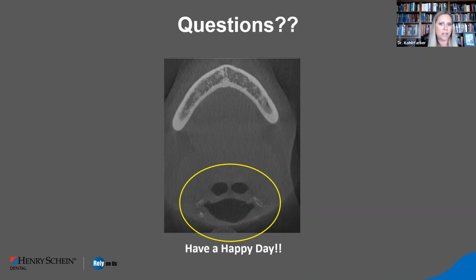In fact, all of my PhD was looking at segmentation and accuracy of segmentation. And we definitely found that the semi-automatic or even manual segmentation is going to be much more accurate than an automatic segmentation tool. There are various thresholds. So some of your software, you might think it's automatic, but it's actually semi-automatic, and you can play with the thresholds a little bit to make it more accurate. But yeah, automatic segmentation is not going to be nearly as accurate as a semi-automatic threshold-based or a manual segmentation tool.